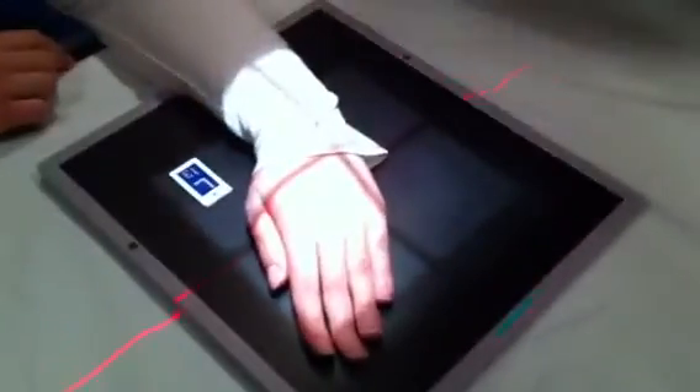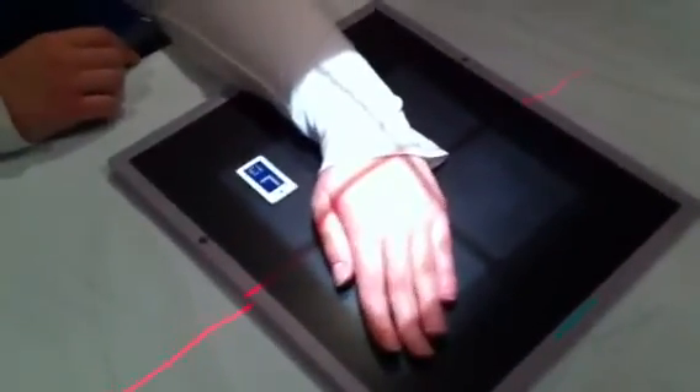You're supposed to mark to the lateral side. Well, it is because it's PA.